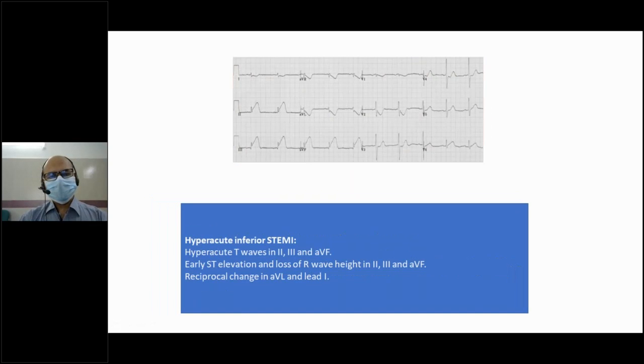This is another inferior myocardial infarction, and all features are present, including reciprocal changes in lead 1 and aVL.